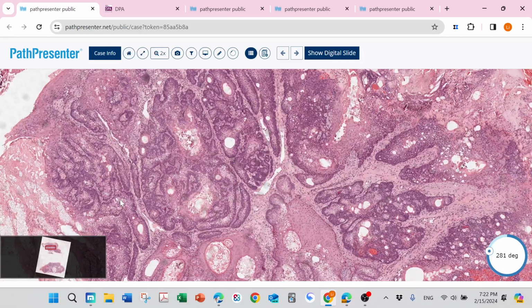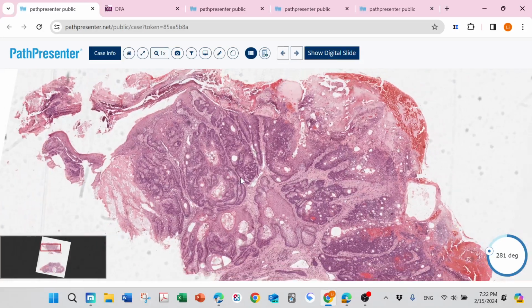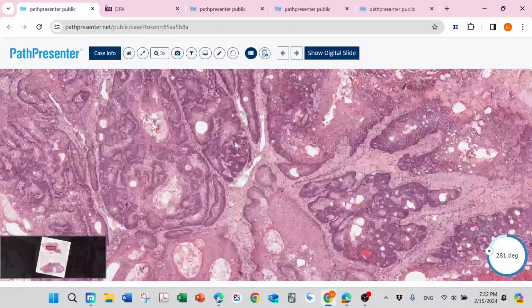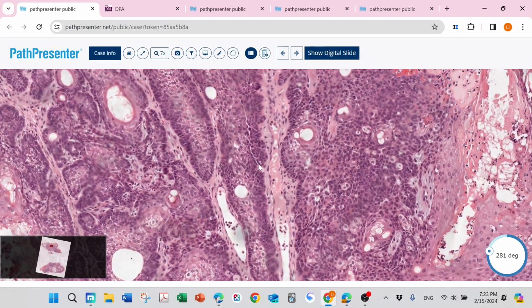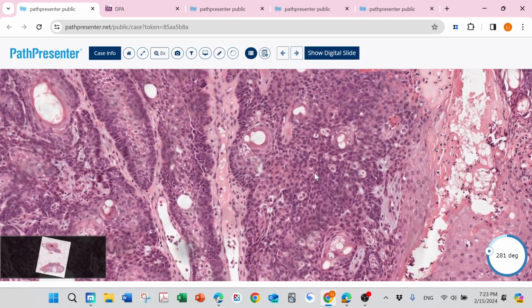You need to bear in mind that for sebaceous adenoma and sebaceoma, we need to see well circumscribed growth. We could not see infiltrated growth. In the cytology, sometimes you may see mitosis, but you could not see atypical mitosis. There may be a little bit of atypia, but not dramatic atypia.